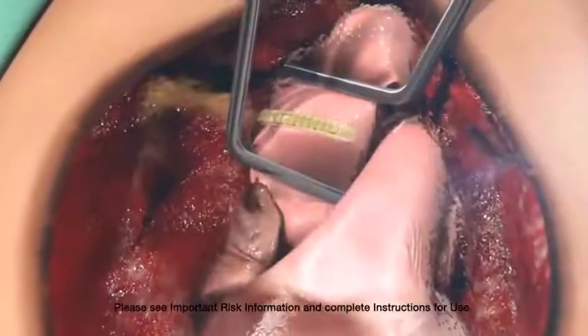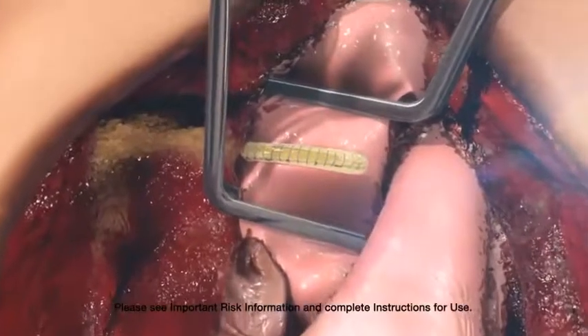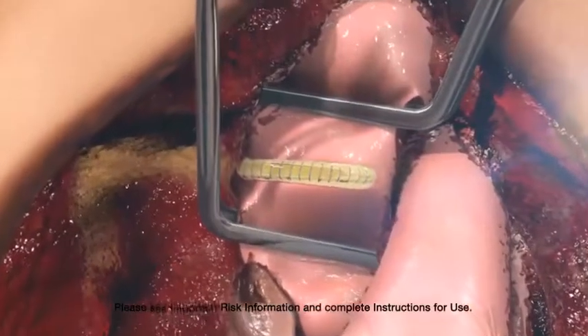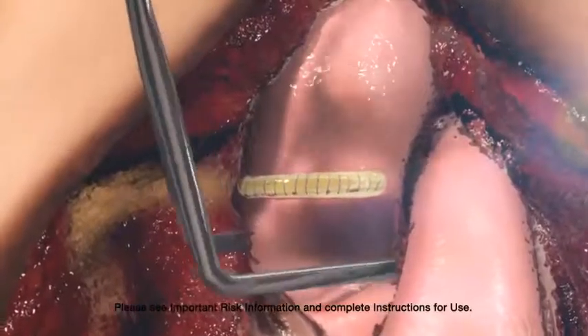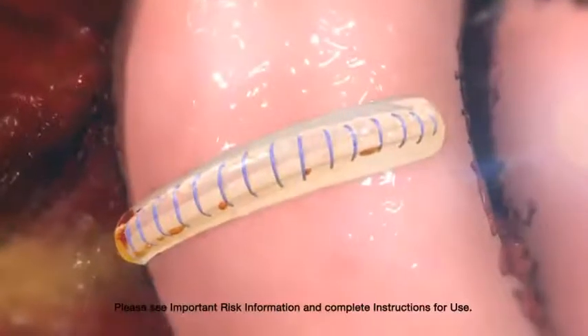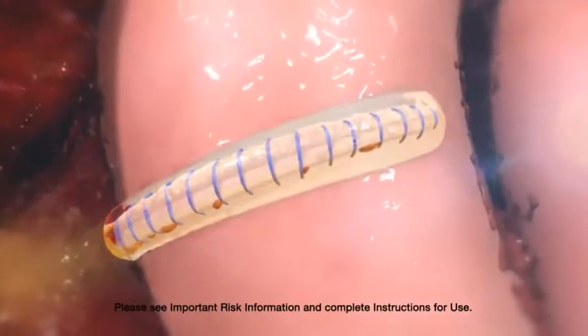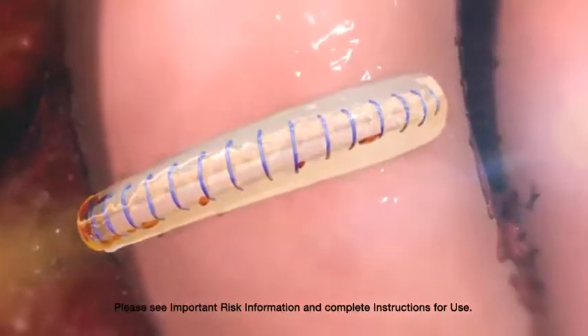Previleak has the strength needed to quickly and confidently seal high-pressure suture lines, with a burst strength in excess of 500 millimeters of mercury. The seal functions independently of the coagulation system, making Previleak ideal for patients taking anticoagulants or antiplatelet agents, or those with other coagulation deficiencies.